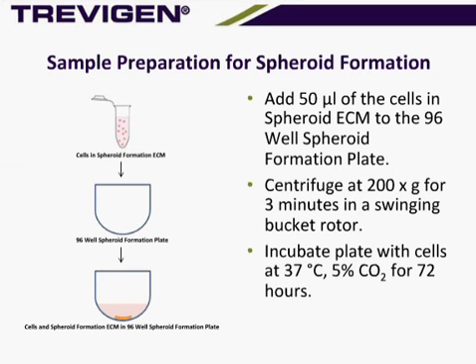And once the 10x spheroid ECM is diluted, it's stable and it doesn't need to be on ice anymore. So once it's diluted, it's now stable. We can work with it in the hood without ice, without any problems. And so we take our cells in the spheroid ECM.